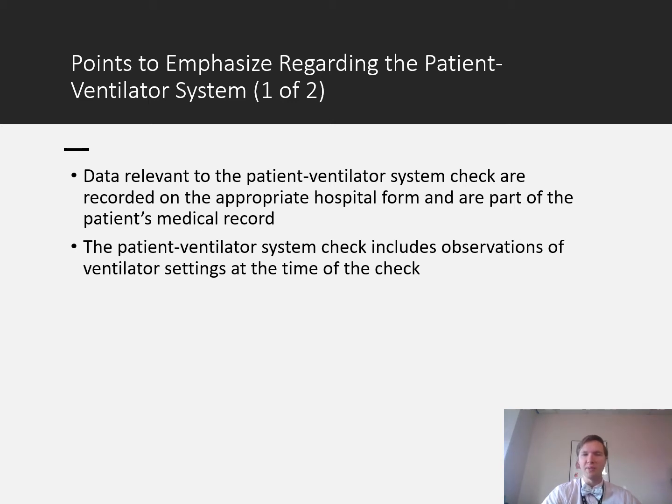It should include observations of the settings at the time of the check, right? So how's the patient doing? Are they looking like they're air hungry? Is there evidence of things like that? Is there auto PEEP and air trapping, right? We need to look at these things.